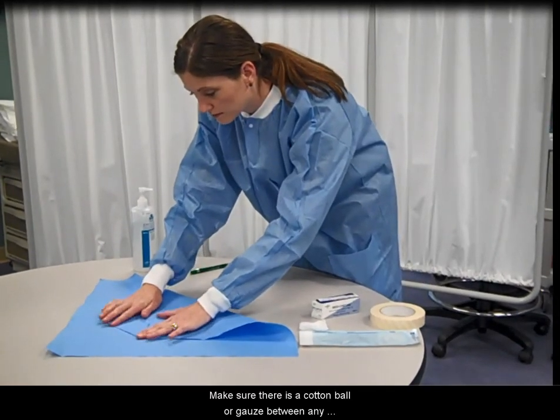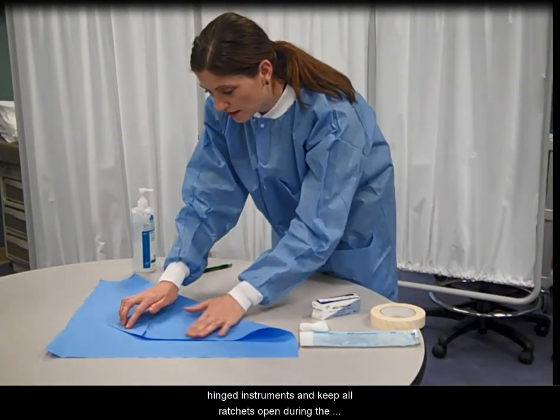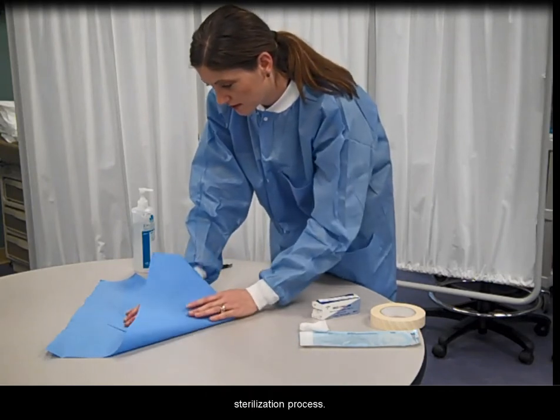Make sure there is a cotton ball or gauze between any hinged instruments, and keep all ratchets open during the sterilization process.